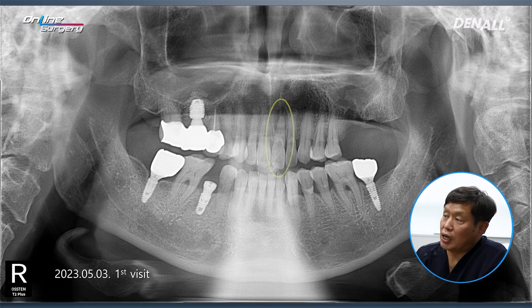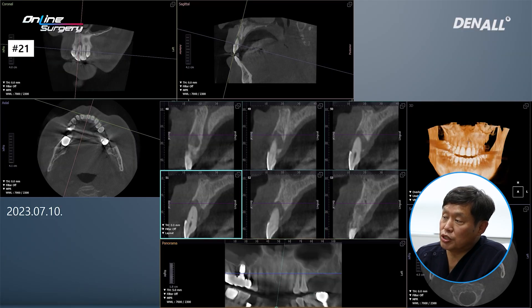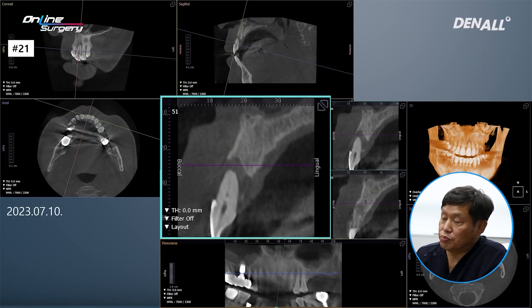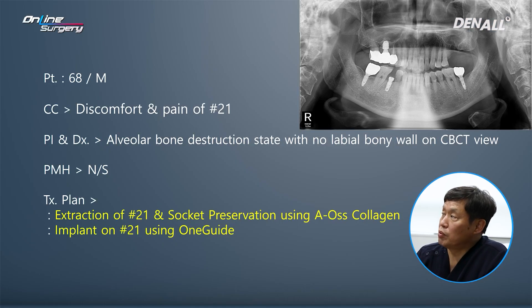The patient's number 21 is severely loose, and he complained of discomfort in that area. Looking at the CBCT scan, we can see that number 21 is nearly floating. On the palatal side as well, bones have been somewhat destroyed. Particularly on the labial side, you can see that a significant amount of bone has been lost.